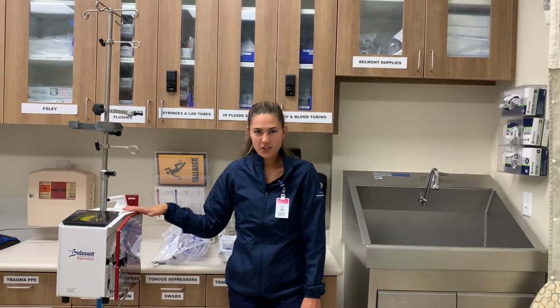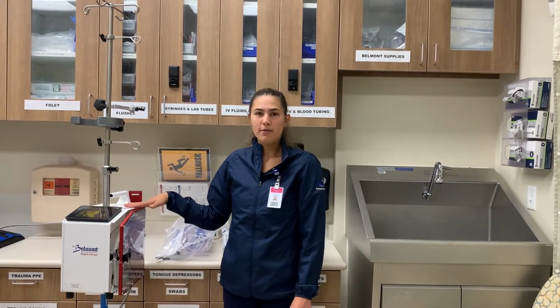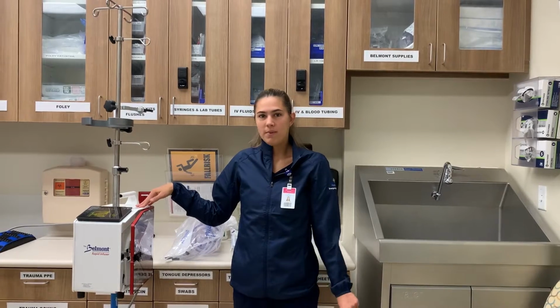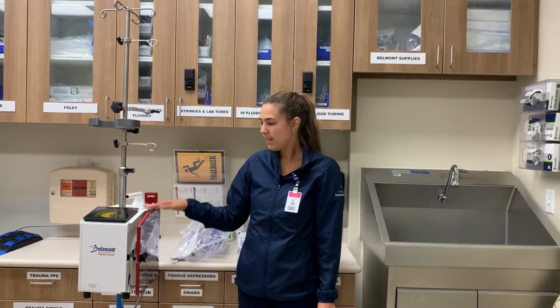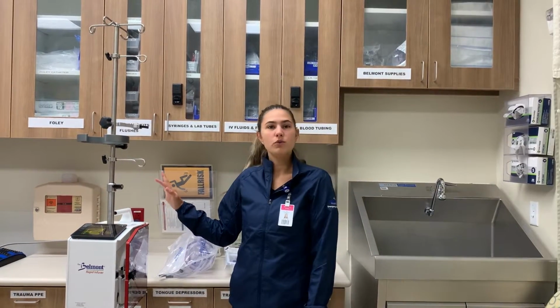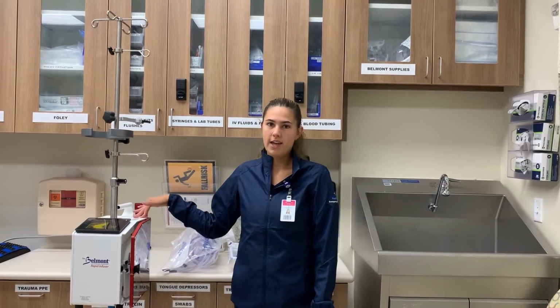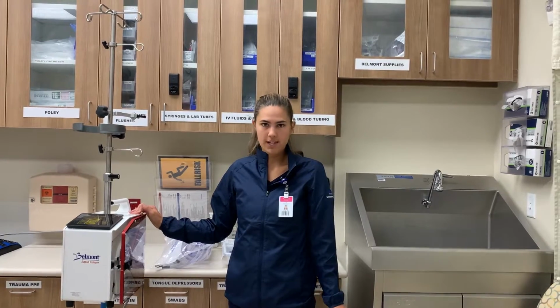If you are planning to rapidly infuse a patient with the Belmont, make sure you have a few liters of normal saline nearby. Do not grab the normal saline from the warmer. Get the room temperature normal saline because the Belmont will warm the fluid as it is infusing. If you try to infuse the pre-warmed fluid, the Belmont will trigger a temperature error. So make sure you use just the room temperature normal saline.